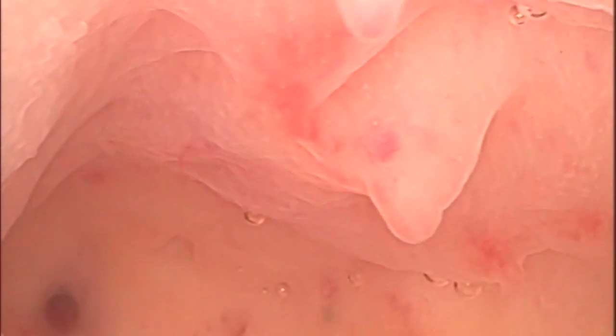The next is the proliferative endometrium, usually seen in the postmenstrual or pre-ovulatory phase of the menstrual cycle. It appears red with multiple vessels visible throughout. The surface is soft, red, and irregular with visible proliferations. The hysteroscope provides magnification, allowing us to see the blood vessels underneath the endometrium in its proliferative phase.